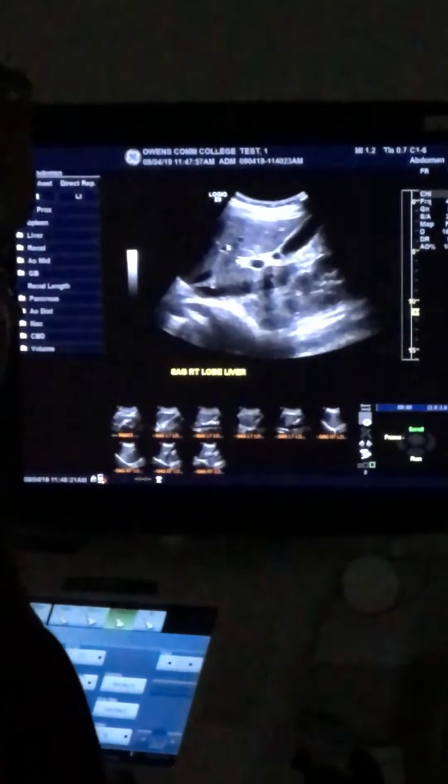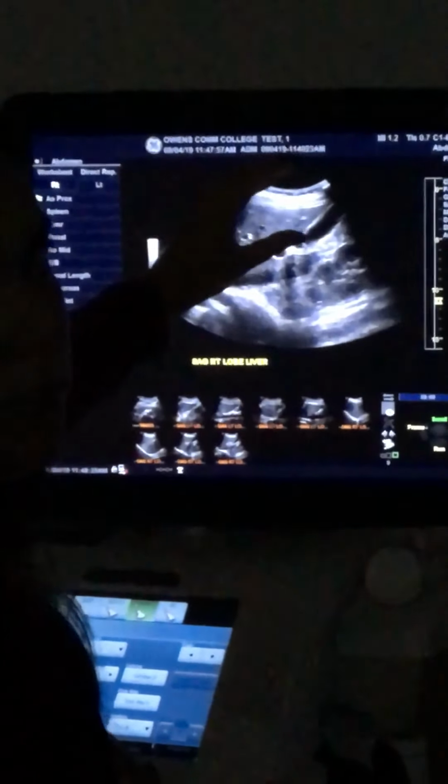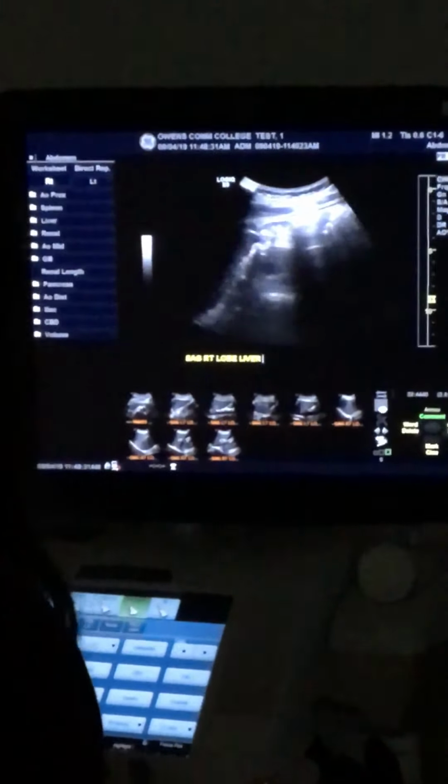So this is where it gets confusing, and you all might want to get out a pen and change this because I forgot to change the labeling. For number 10, we just did number 9. Now we're going to take a little pause on the liver and take a minute to look at the common bile duct individually. So change the labeling to long common bile duct, that way it doesn't confuse you later. For number 10? Yeah, number 10. When I do this at work, I save common bile duct for the very end, but it doesn't really matter as long as you get it in.